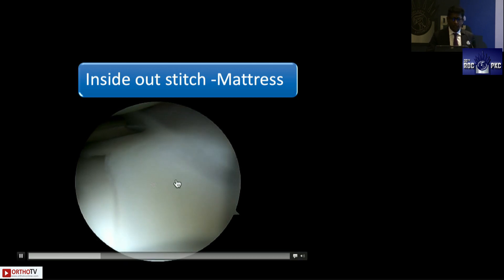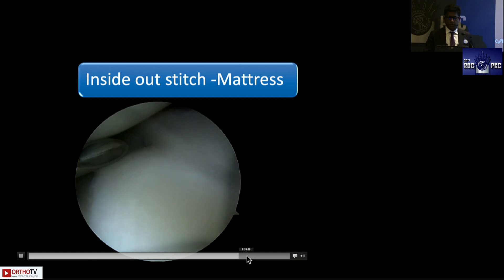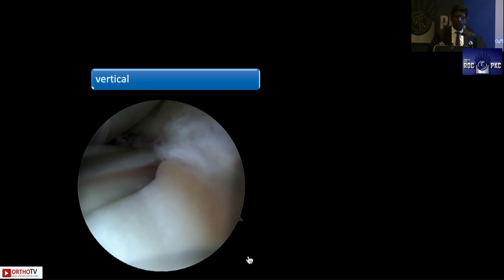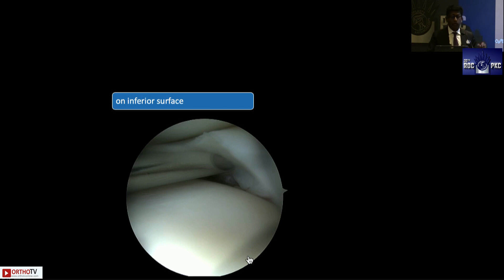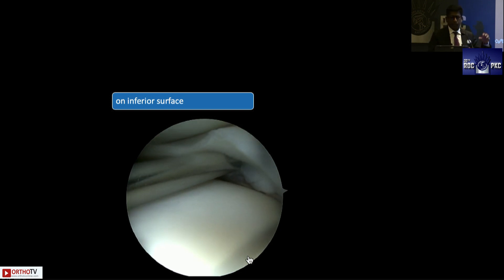With inside-out technique, you can use mattress stitches and vertical stitches. The cannula guides you where to place the next stitch. Your assistant retrieves the needle from outside. Alternate vertical stitches — one over the capsule, one over the meniscus — with mattress stitches, since vertical stitches have greater mechanical strength. Do at least one stitch on the superior surface and one on the inferior surface to balance the meniscus, because doing only superior surface stitches will evert the meniscus.